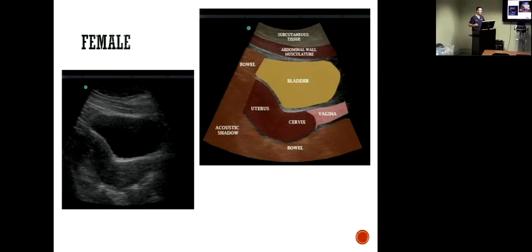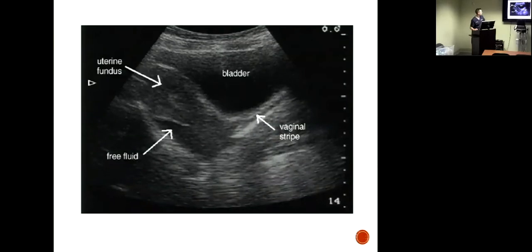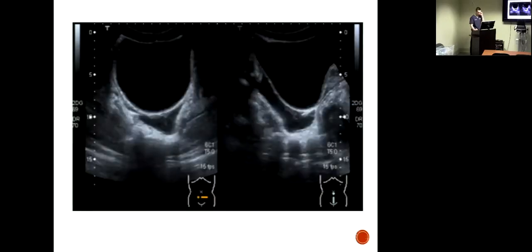It's the most dependent spot in the body we're looking at. Fluid anywhere out here and sometimes even under there. So it's very difficult to tell on this view sometimes, but you're seeing bladder, here's uterus, vaginal canal, and then you have some dark spots behind the uterus there. That's positive. Again, a fluid collection or black outside of the box, that's fluid. Positive over here too. All this is positive.